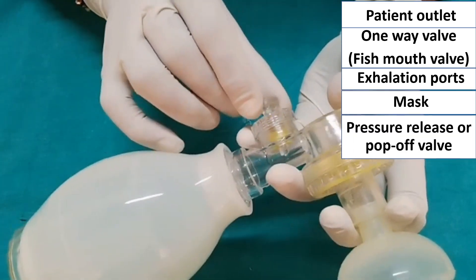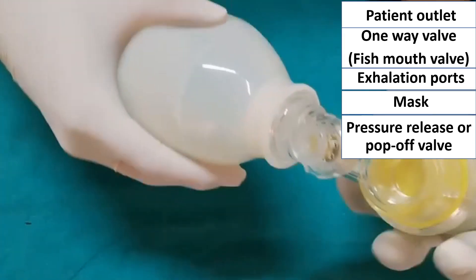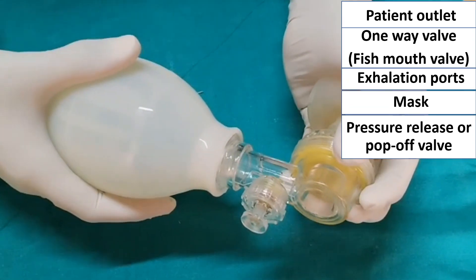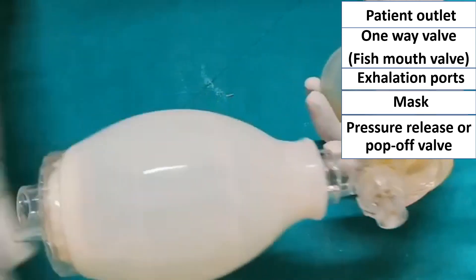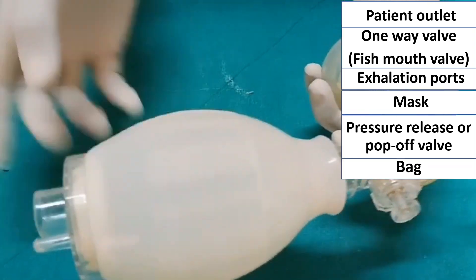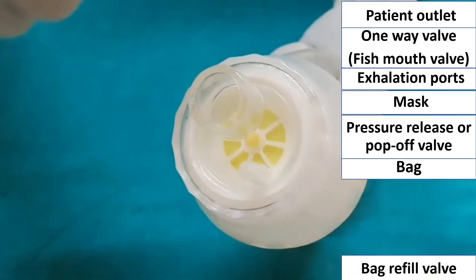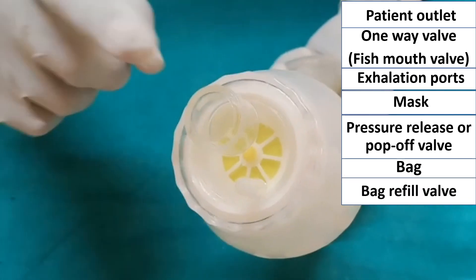This is the pressure release valve, or pop-up valve. Now we have to check the bag — here you can listen to the hiss sound. So the bag is properly working; no leak is there. These are the bag refill valves.